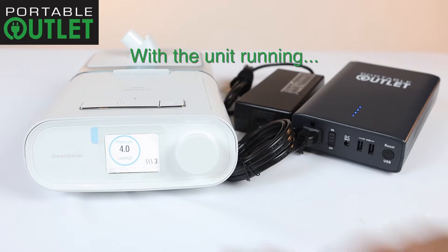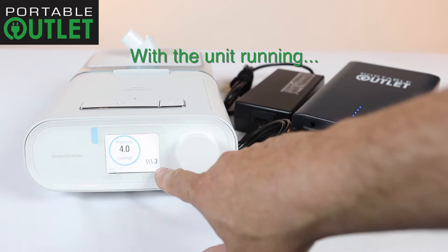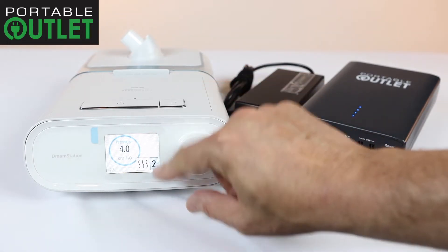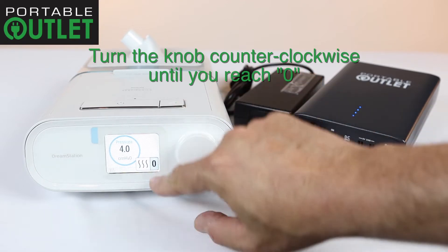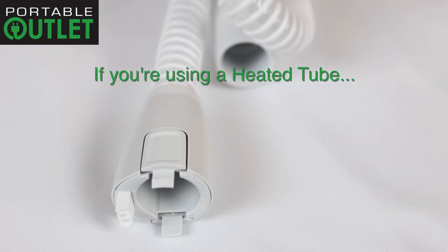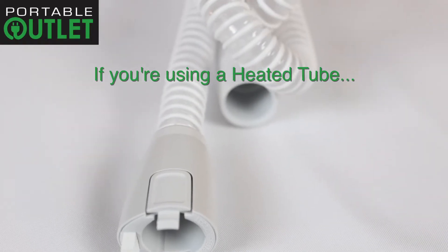When the device is on, you will notice the steam icon in the bottom right corner with the humidity level next to it. Simply turn the large knob counterclockwise until you reach zero. At that point, the humidity level is off.